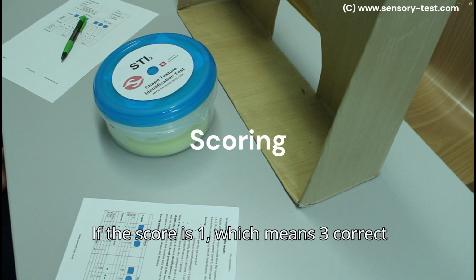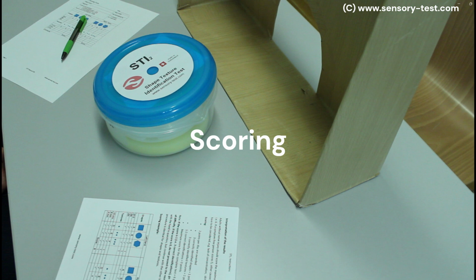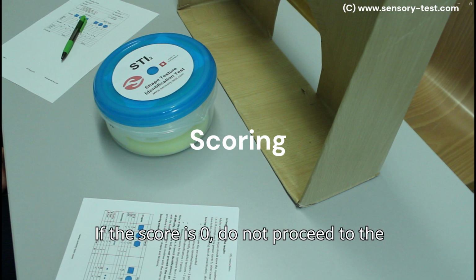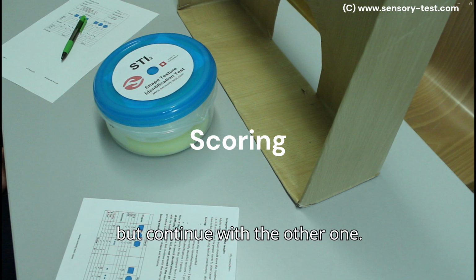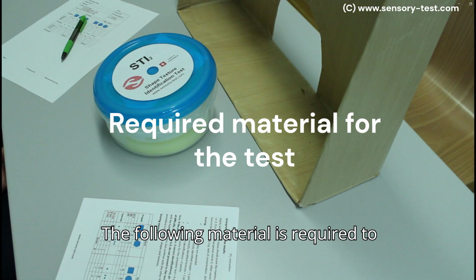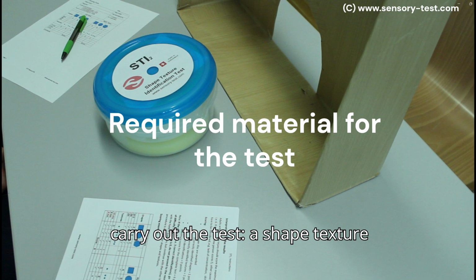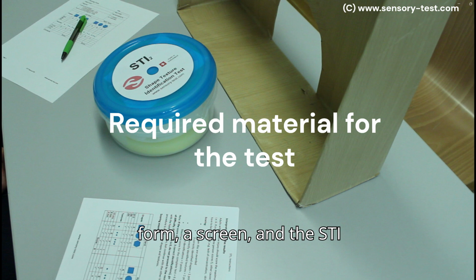If the score is 1, which means 3 correct identifications, move on to the next level of difficulty. If the score is 0, do not proceed to the next level of difficulty with this hand, but continue with the other one. The scoring procedure is identical with shapes and textures. The following material is required to carry out the test: a shape texture identification test, a test scoring form, a screen, and the STI instruction manual.